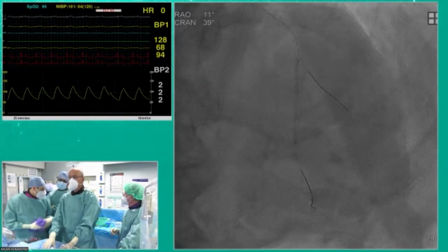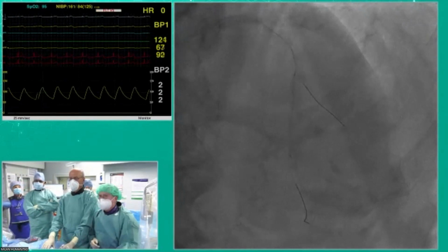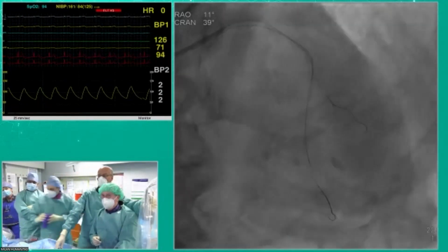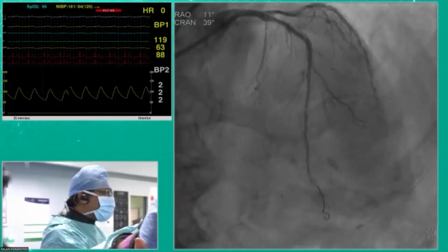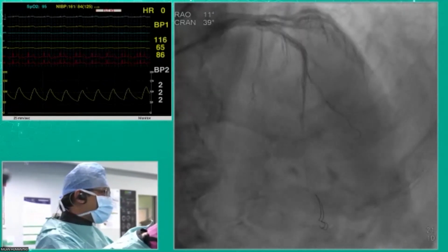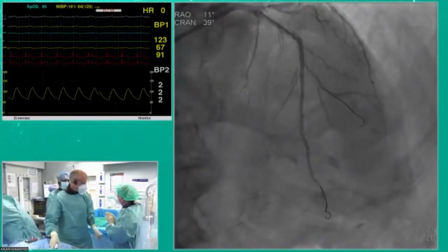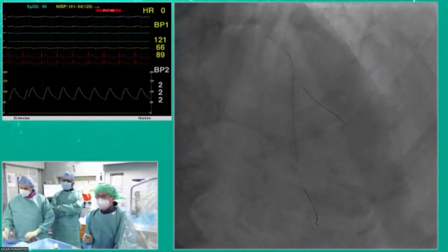Lumen is quite good, actually. Good, but a small linear dissection is also there. And I'm in support of deploying a stent at this, because it's all mid-LAD and we don't want to lose... This lumen is not bad, eh? But still the dissection you can see. Yeah, but when you have an advanced disease, the only way to dilate a lesion is to dissect. Yes. But then Prem had decided to stent before the wire was passed.